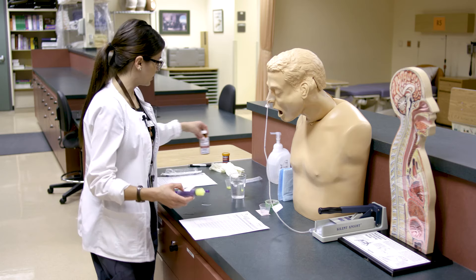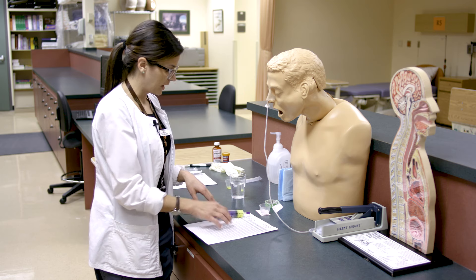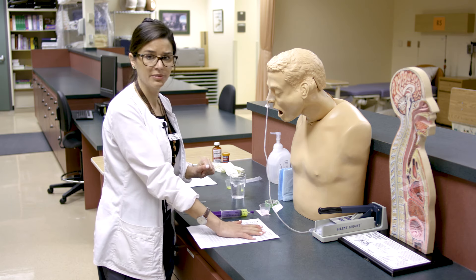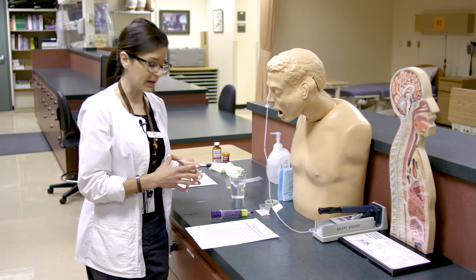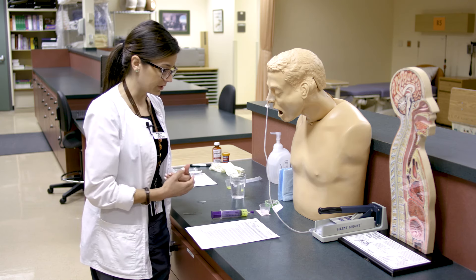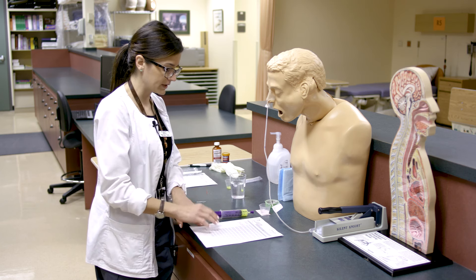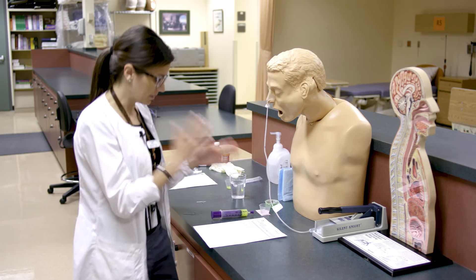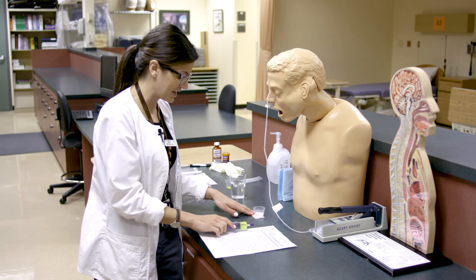Now we're going to approach our patient. We'll talk to them, introduce ourselves, and do a safety check. We'll ask him to confirm his identity, check it against his wristband, and ask about any allergies. Then we'll do our third check with the MAR, our medications, and labels. After that we're ready to administer. I'll skip ahead to show the administration in a timely fashion.